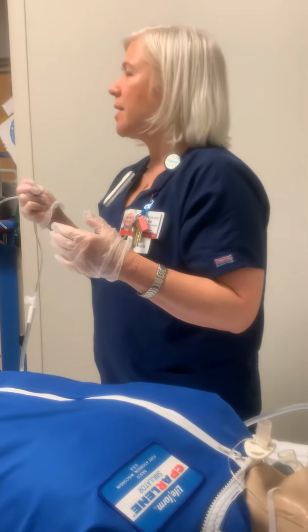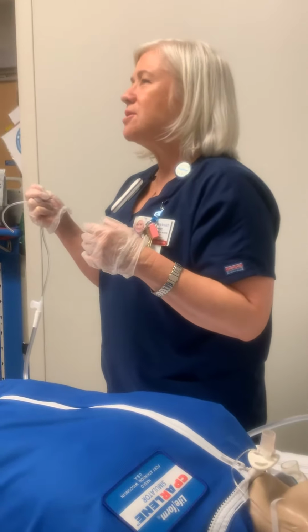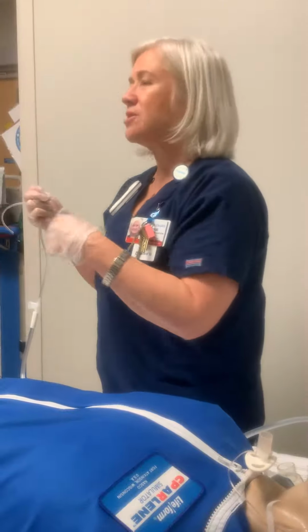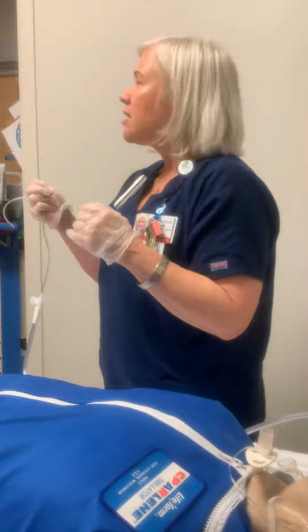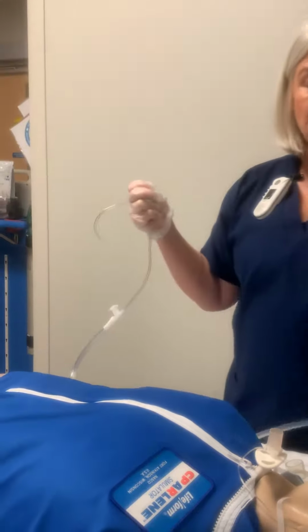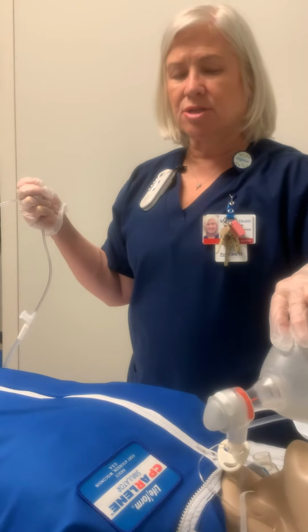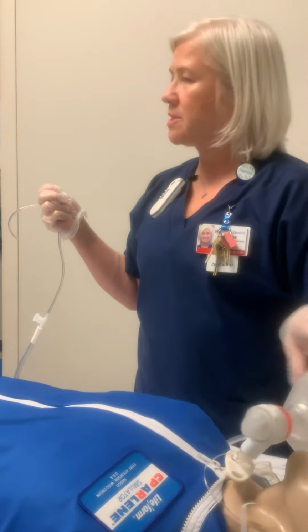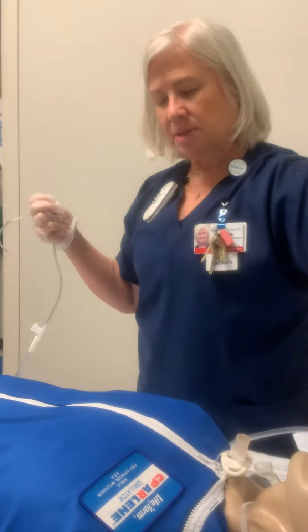And he says to me, you ever felt, it's like a vacuum cleaner in your lungs. And it's just pulling, there's no way you can take a breath because you're sucking everything out of me, okay? So you'll need to ambu this trach here, suction, or give them about 100% of a few deep breaths here. Then you want to go down.